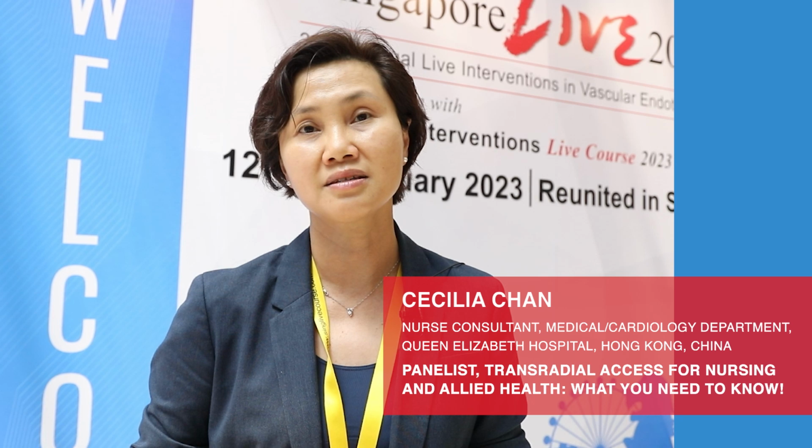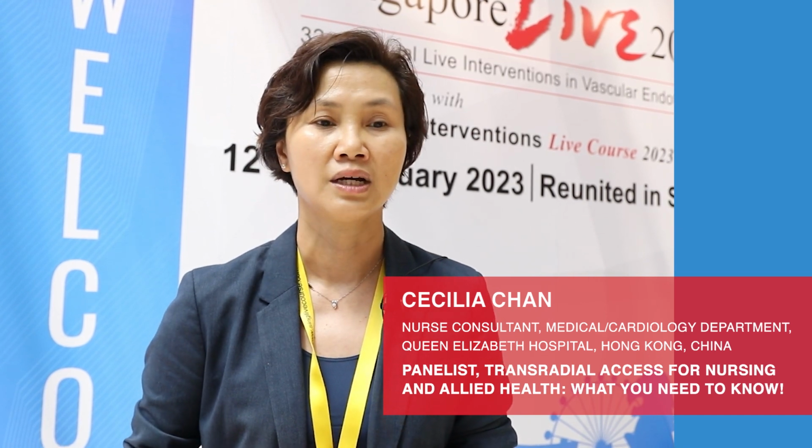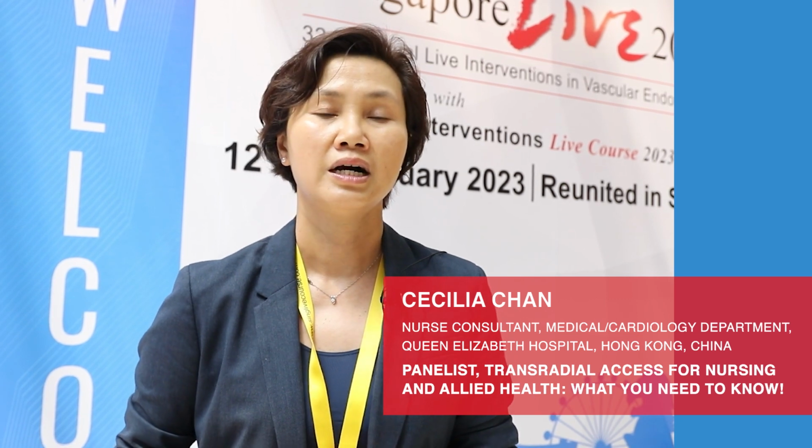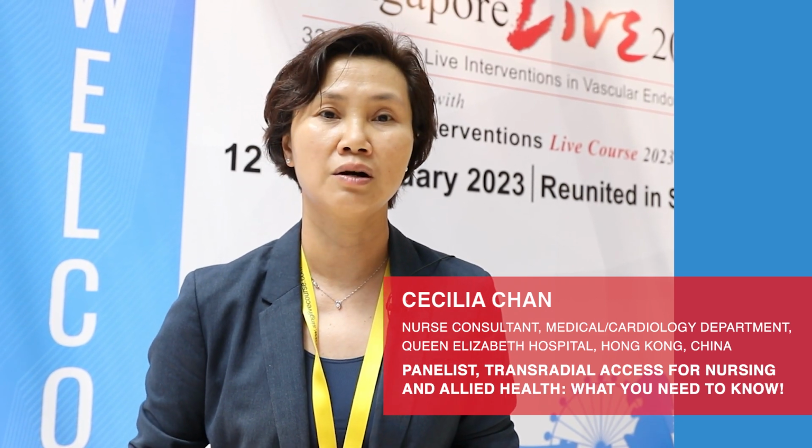Preventing complications after intervention through transradial access, I think more important is preoperative management and assessment. As a nurse, we have to assess the transradial access site before the procedure. We will do the Allen test beforehand to see whether the ulnar artery and also the radial artery are patent. If yes, positive, then we will inform the doctor you can proceed with the procedure through transradial access.